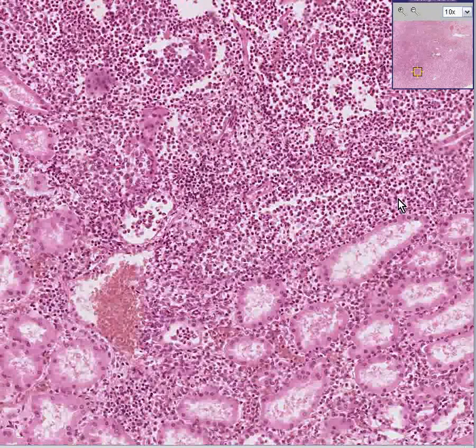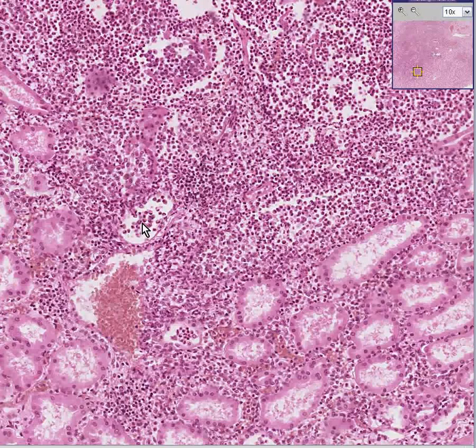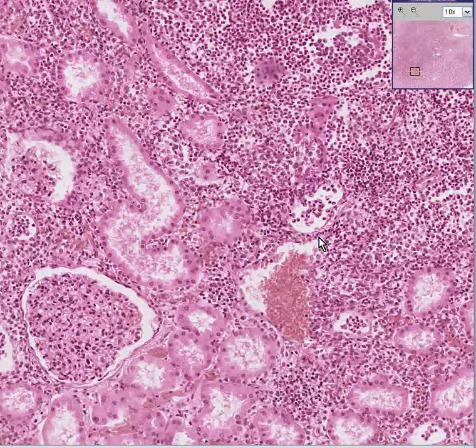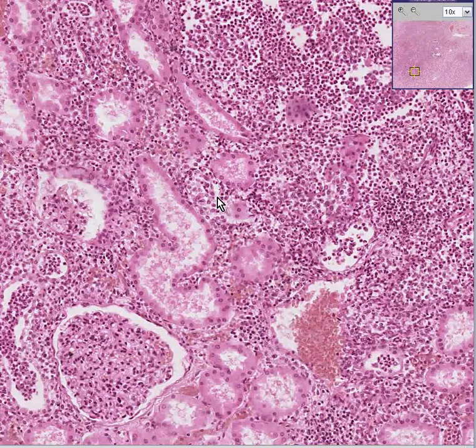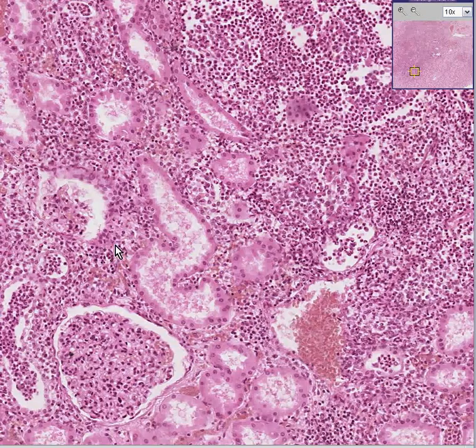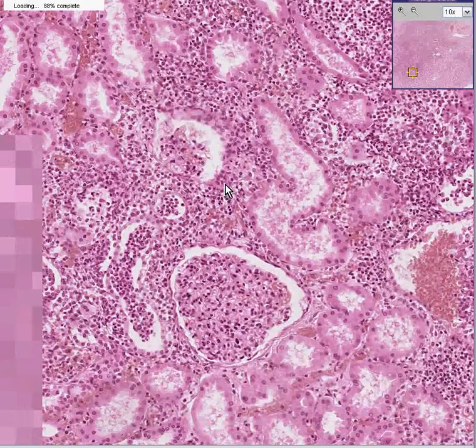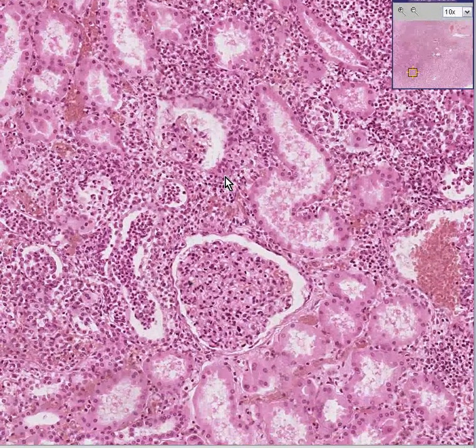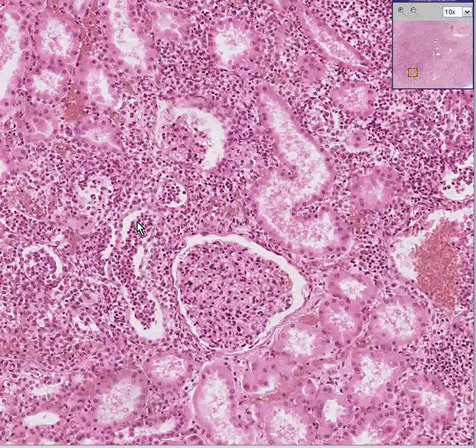This is a large tubule that's been destroyed. Here's a tubule that has some inflammatory cells. This primary acute inflammatory process, acute pyelonephritis, once again caused by the ascending gram-negative rods — E. coli, pseudomonas, and so on — the same things that infect the lower urinary tract.